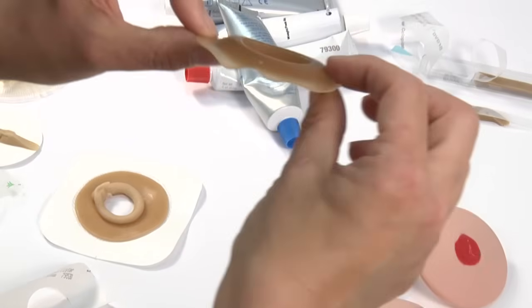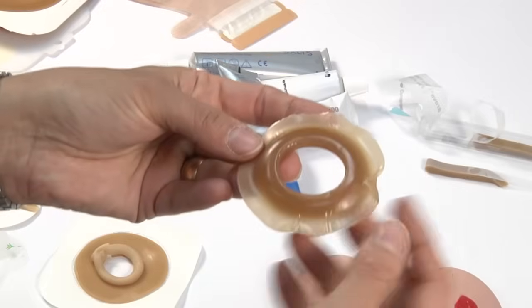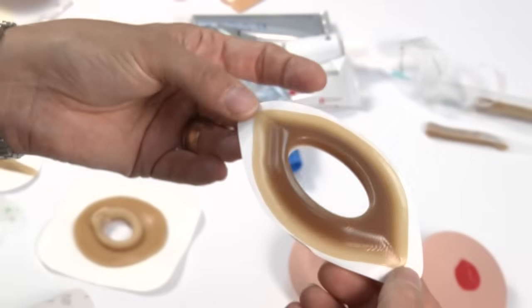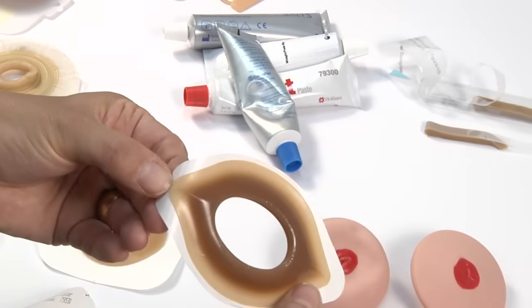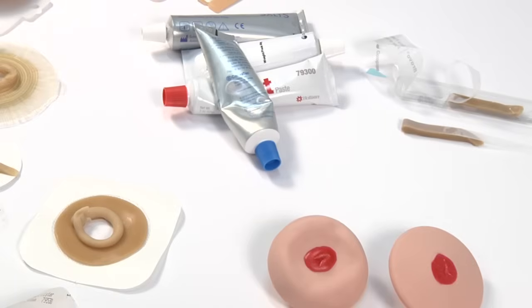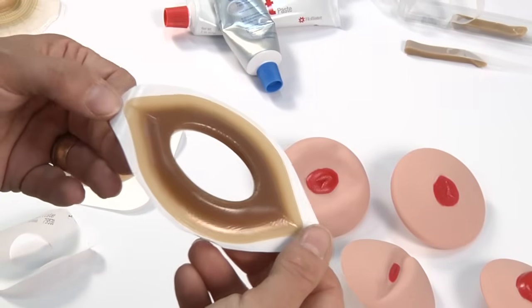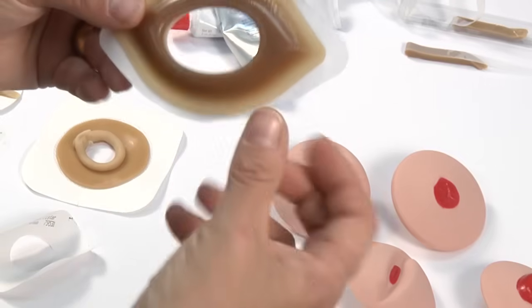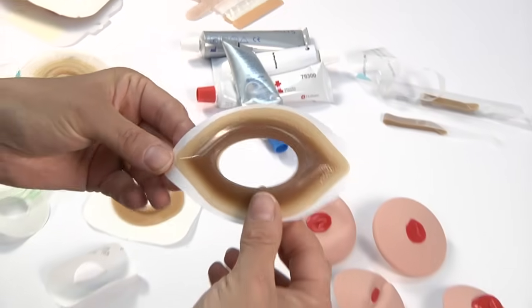But it does add, as I said, a fair amount of convexity on the back of a flange. So if you're not getting enough convexity with the flange that you've pulled off the shelf, it may be that by stacking this on top of it you'll achieve the convexity that you're looking for. These are extended wear barriers, so they absorb an awful lot of moisture, and something to consider is that in contact with the skin, if you're getting an extended or long wear time, you may see a little bit of maceration, or the openings may be too tiny and they will swell up and actually occlude the opening. So be careful of that with your smaller stomas.